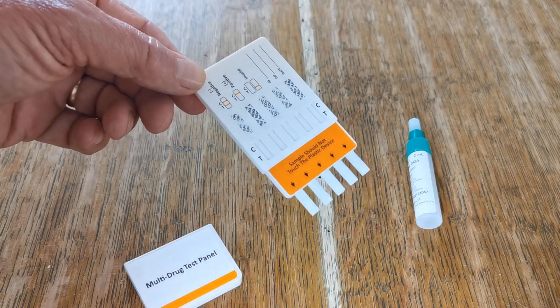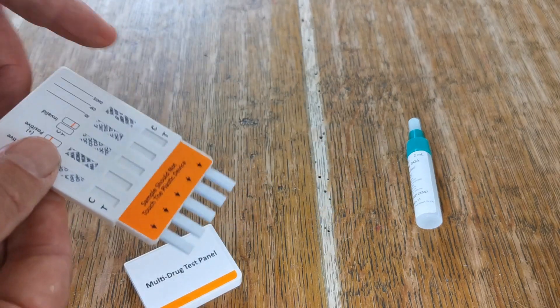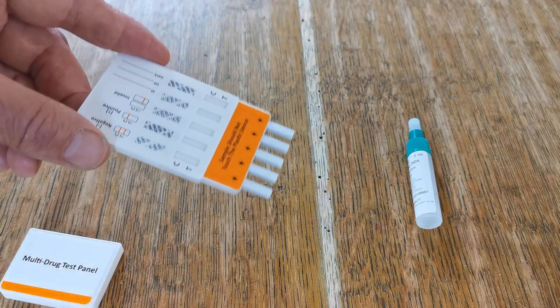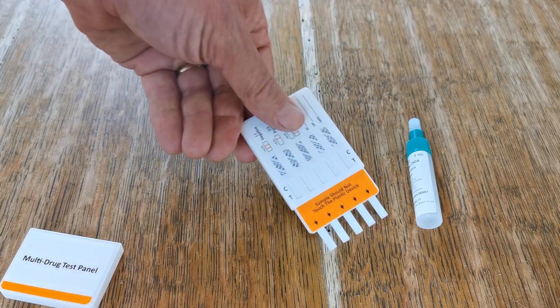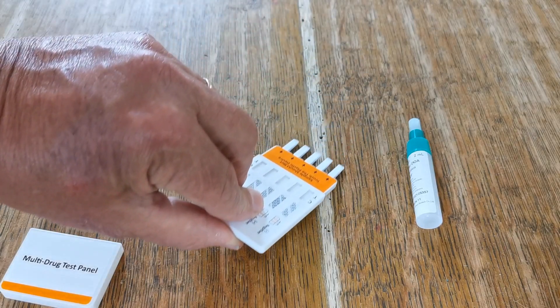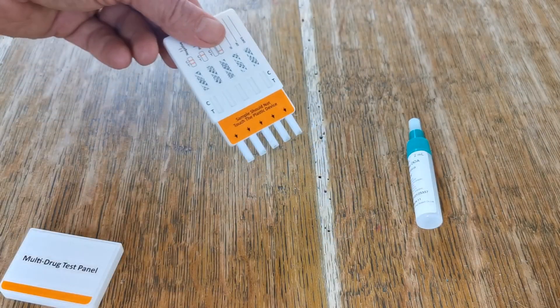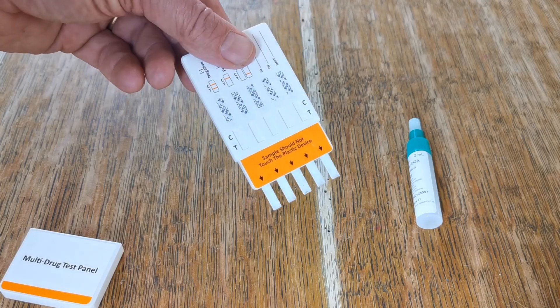The mechanism for collecting the sample is to test surfaces for residues of drugs. The straightforward procedure on a surface you suspect may be contaminated is to simply wipe both sides of the test across the surface, keeping it as flat as possible to pick up any residues. You can see some residue collecting on those prongs from this table surface.